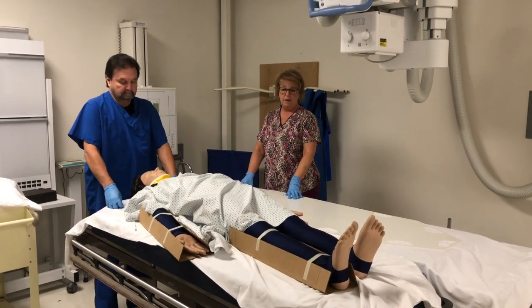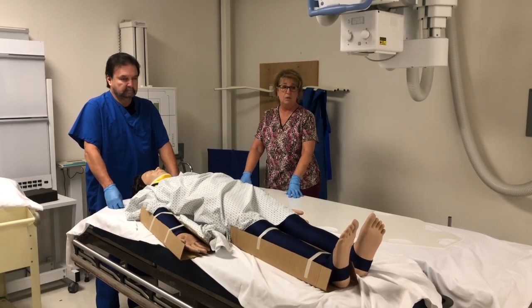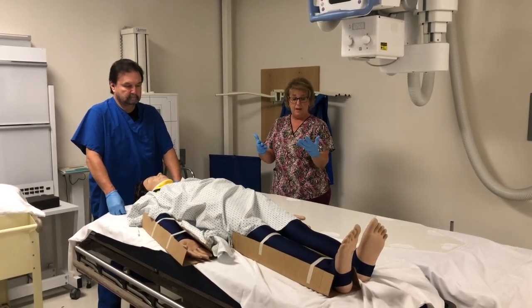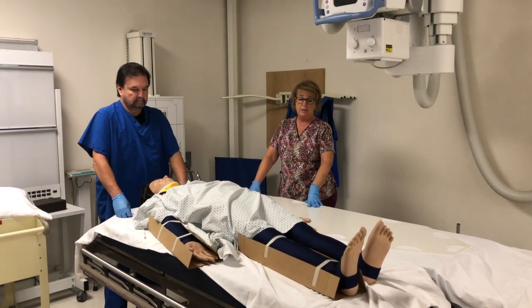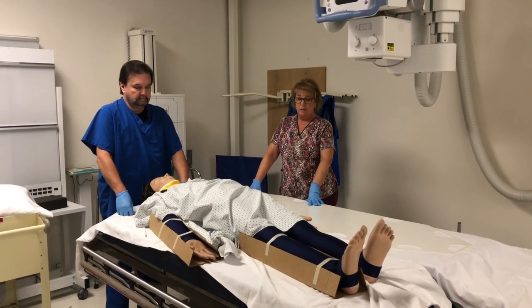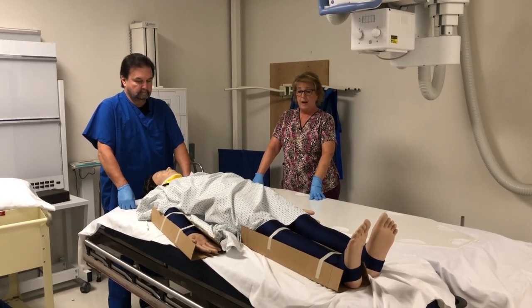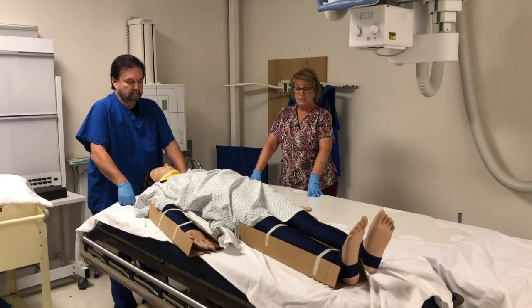Frequently there is going to be blood or body fluid. It's typical in head injuries for patients to vomit. And so you always want to have whatever protective body apparel is appropriate for the scene. Right now we're going to assume that maybe this patient has a little bit of blood because they've got some suspected limb fractures, as well as maybe neck or spinal injury.